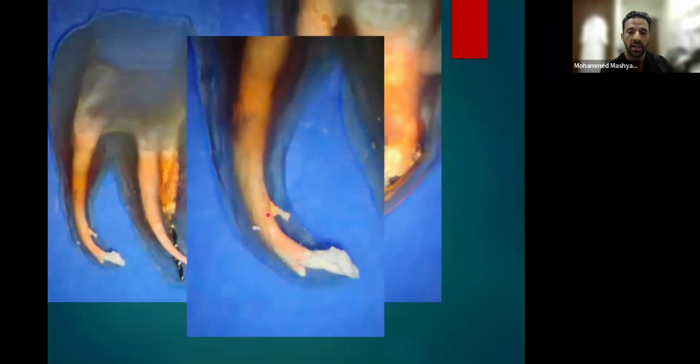And look at this canal tooth here. I want somebody to tell me there is extra anatomy here and extra anatomy here. Can you tell me which one is a ledge? The one on the top or the one on the bottom? Can you answer that?